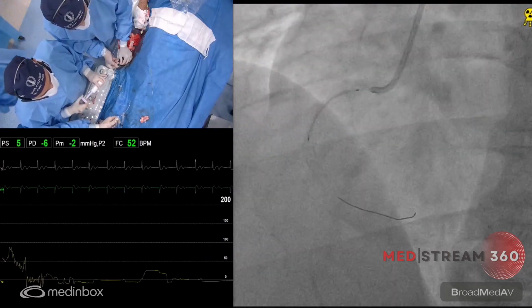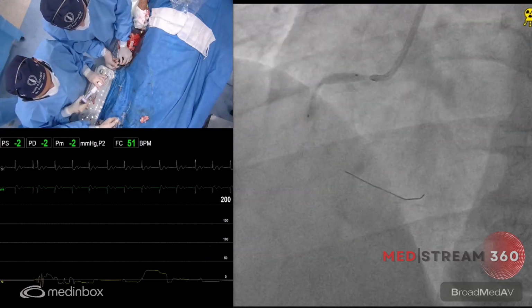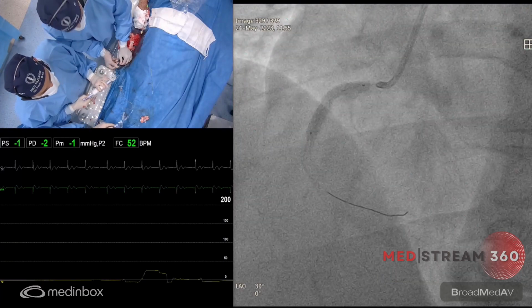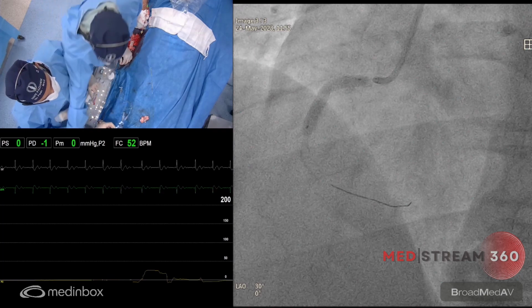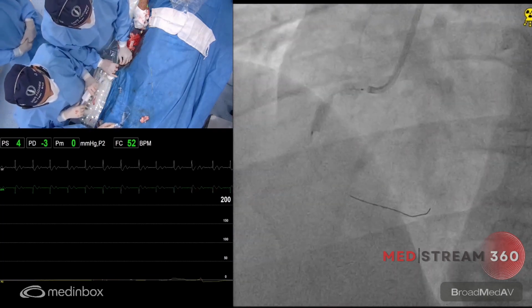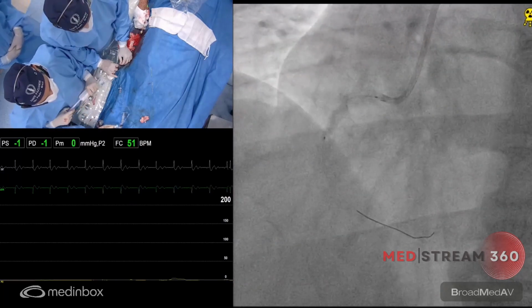Okay. Could you say again, please? 10, 12. More. 16. Okay, we are going to be finished now, just to see the final result by angio. And you did IVUS, but it's fine.